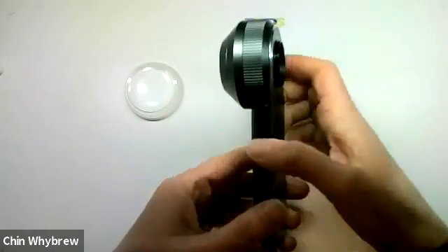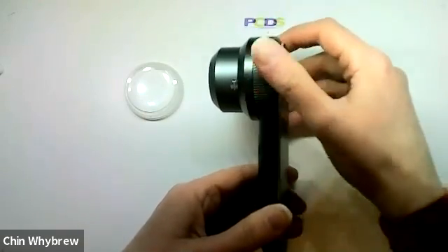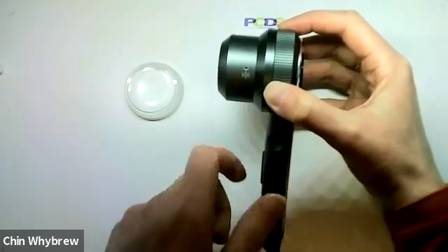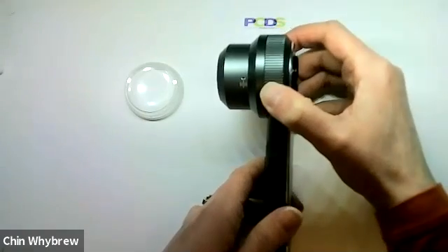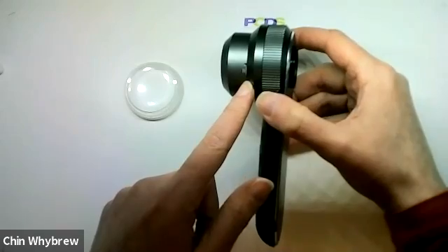To focus this one, you twist this part here, and as you can see the end plate extends. This little marking here shows you where it is when it is perfectly focused for a flat lesion, which is exactly there.